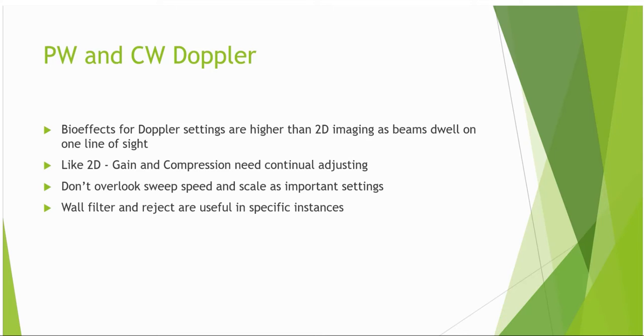When looking at peak velocity, we can afford high filter settings as we aren't concerned with flow in and around the baseline. When assessing low flow velocity, or looking to trace a VTI back to the baseline, then the filter setting should be low to allow accurate tracings.